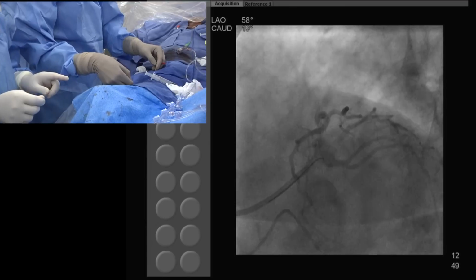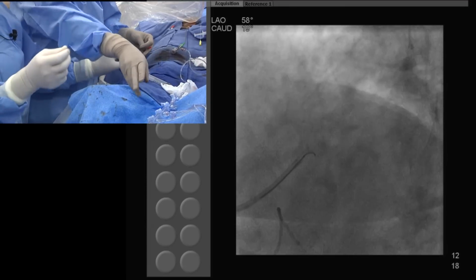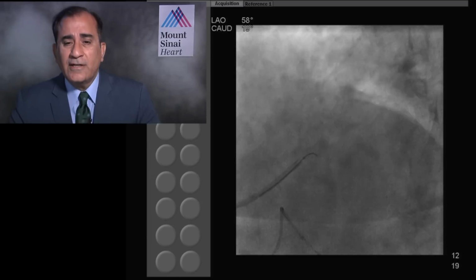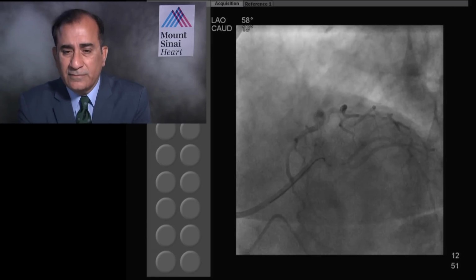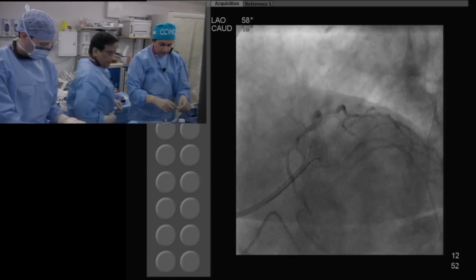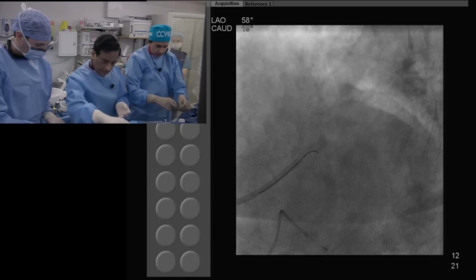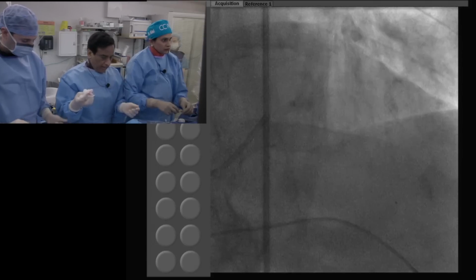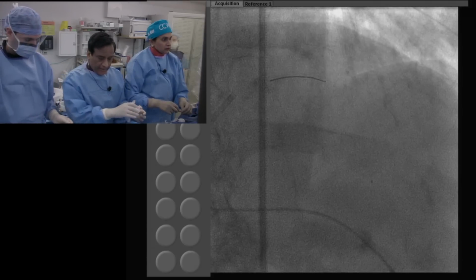Samin, another question for you here. Unprotected left main and rotablator, would it not qualify for Impella? As we said, we had a little discussion earlier. We did the Protect trial, and we were the second lead enroller because we started 1 year later.